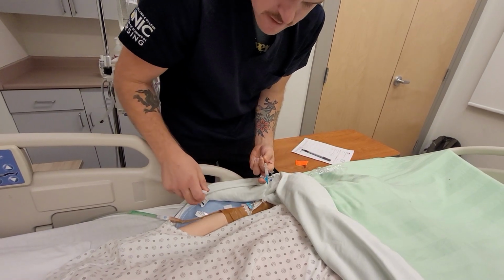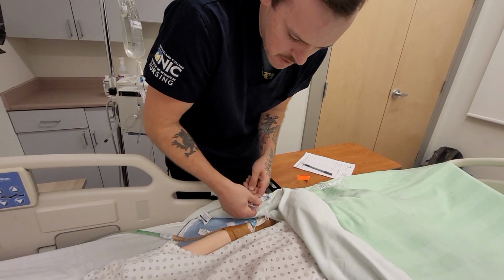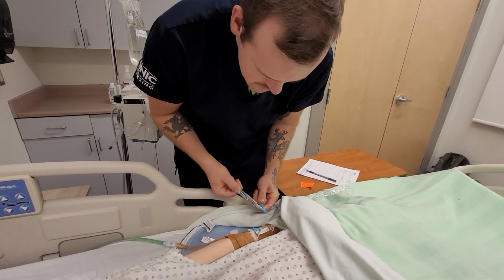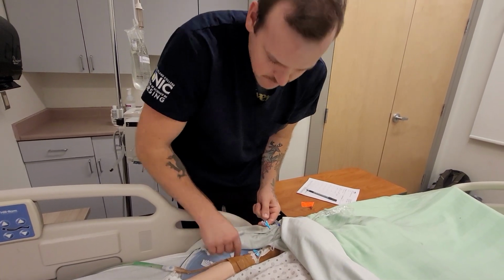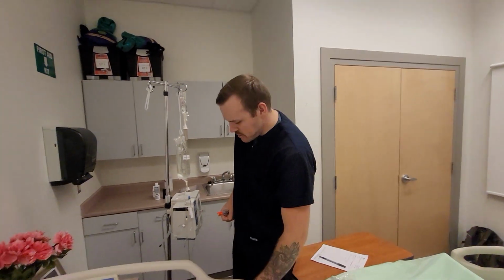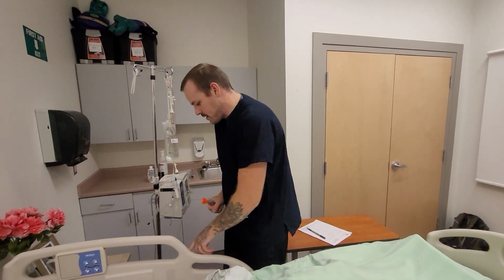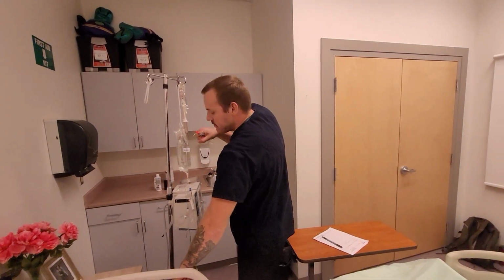Next, we're going to be affixing our normal saline to be pushing at the same rate for 2.5 mils. Great. Take that off, uncap. We're going to restart our infusion. We're going to make sure we reassess every 2 to 3 minutes until we get that desired response. Make sure we bring the bed down to safe working height, call bell within reach. IV drips in the chamber, we're running.